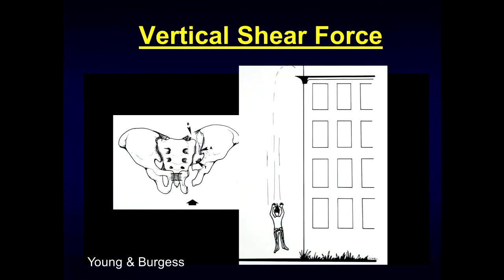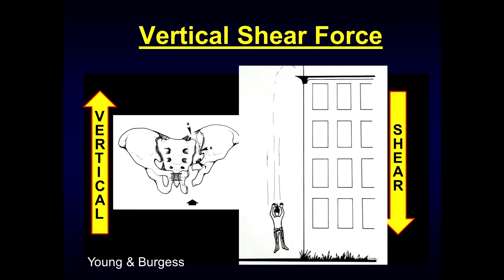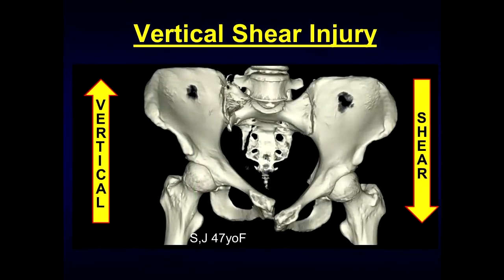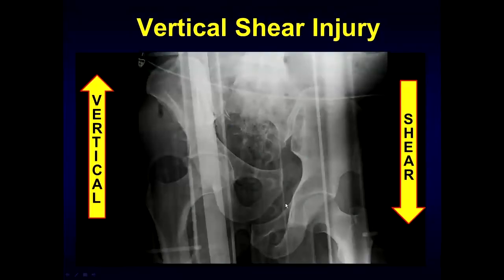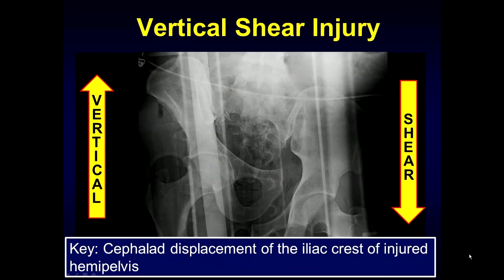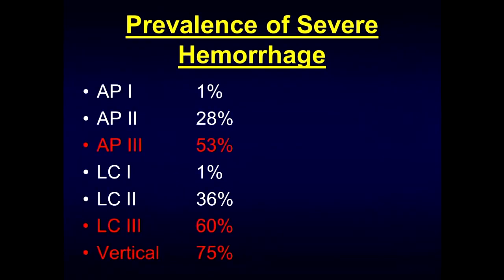Vertical shear injuries occur from falling from a height, typically with differential force — one leg is longer and contacts the ground before the other side. What occurs is vertical shearing of the entirety of the involved hemipelvis. On CT 3D, we can see the offset at the pubic symphysis and the injury pattern through the right sacral ala. In this individual, the right hemipelvis is elevated compared to the left, with offset at the pubic symphysis and widening of the left sacroiliac joint. Look for that cephalad displacement of the iliac crest of the injured hemipelvis.